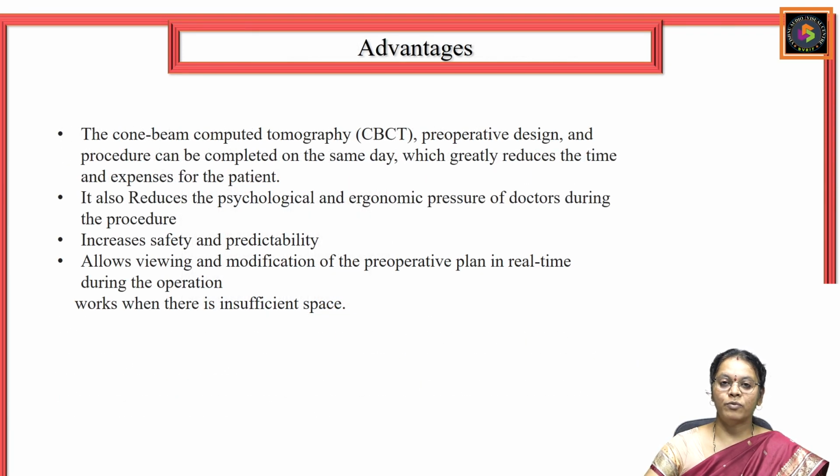As discussed earlier, the advantages of this dynamic navigation system are that they give a pre-operative design perfectly and the procedure can be completed in the same day, wherein the subject need not be hospitalized, and on the same day he can be discharged and he can move on. It also reduces the psychological and ergonomic pressures on the doctors because there is clear visualization between the operation site and the reach of the surgeon to the operating site. So it relieves much of the pressure on the surgeon during implantation surgeries, enabling high safety and predictability.